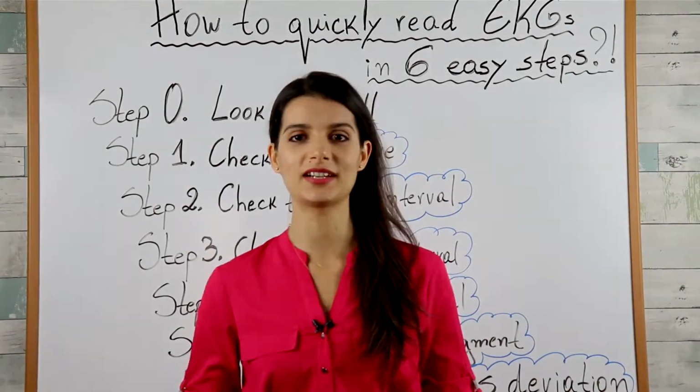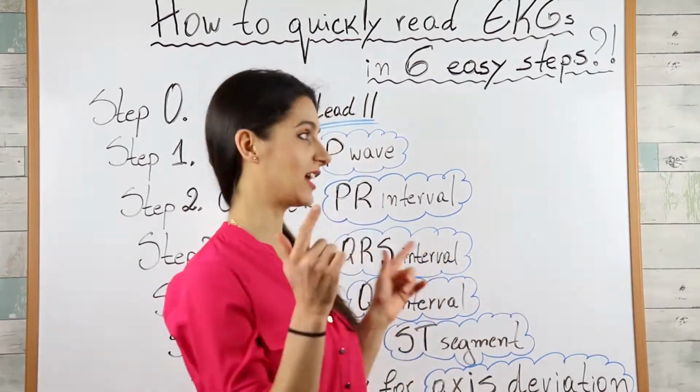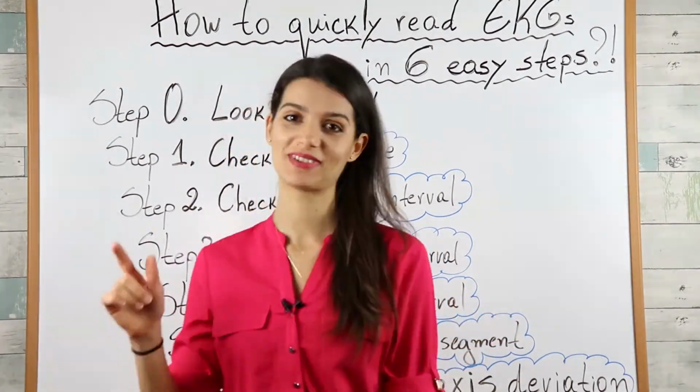Would you like to quickly learn how to interpret EKGs for the steps and for your future clinical practice? Here are the only 6 steps you ever need. Coming next.